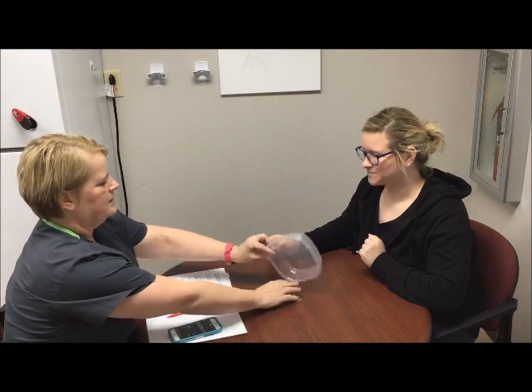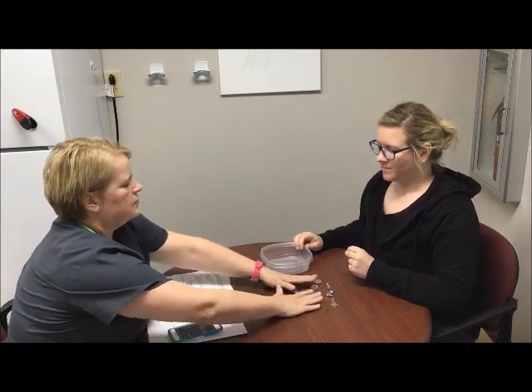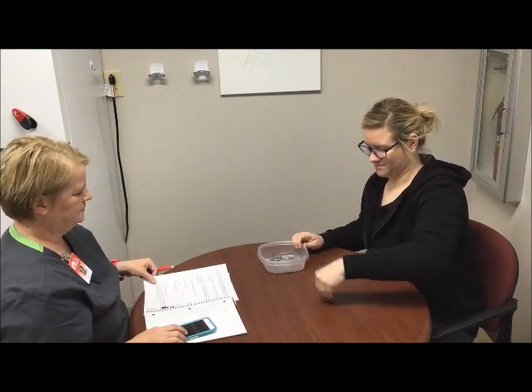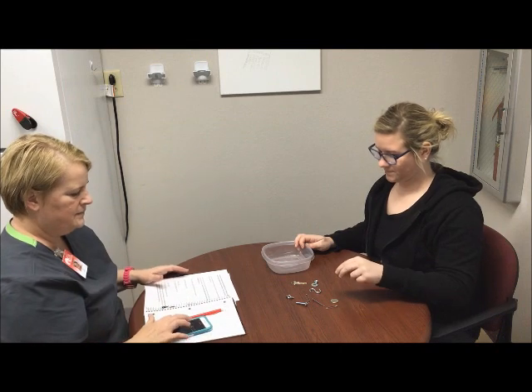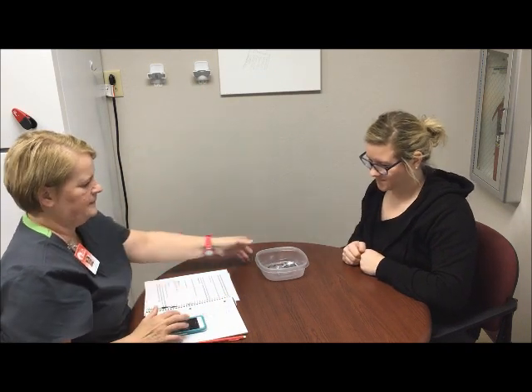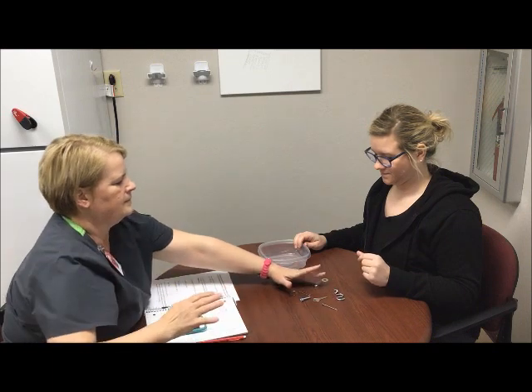So I'm going to pull these back out and you're going to hold the container with your right hand and pick everything up with your left hand. Okay, ready? [Left hand trials proceed.] Okay, one more time with your left hand. Okay, ready.